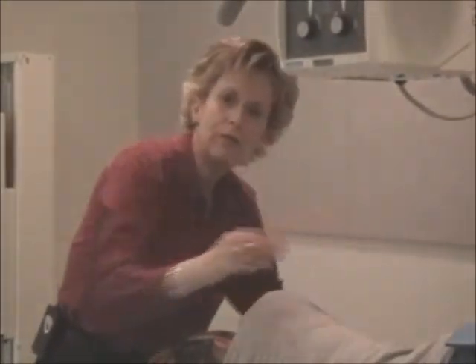Now, obese patients, you're going to have a lot of tissue out here, and you need to keep in mind that a patient might be large, but they could be firm. Organs are going to tend to be held in place. If a patient is large and not firm, the stomach will tend to fall more forward. So what we're giving you are not precise positioning reference marks, they're guidelines. And you must think of patient habitus and patient condition and adjust accordingly. That's one of the pleasures of our jobs, because we're not button pushers. We do have to think through this.